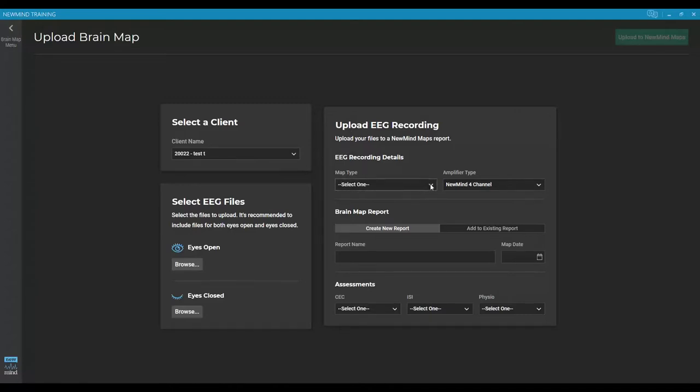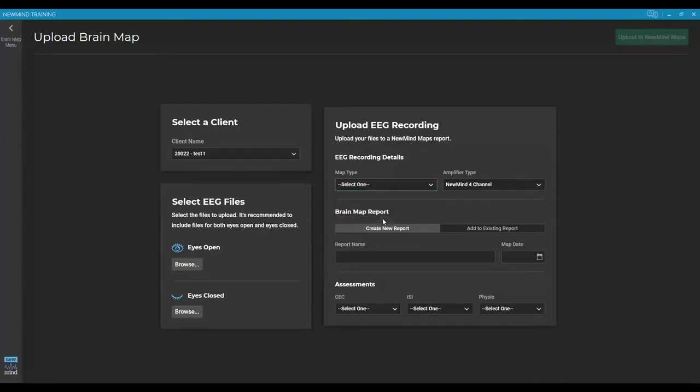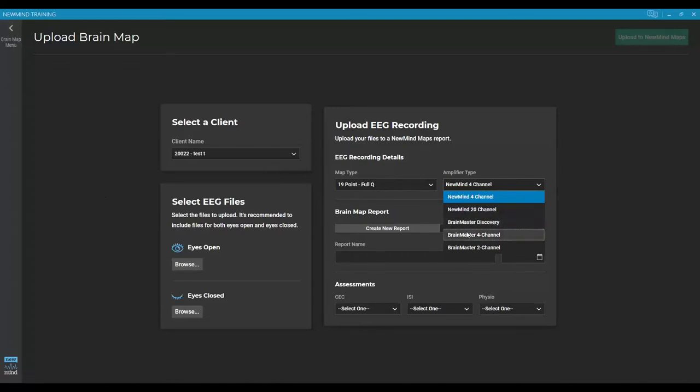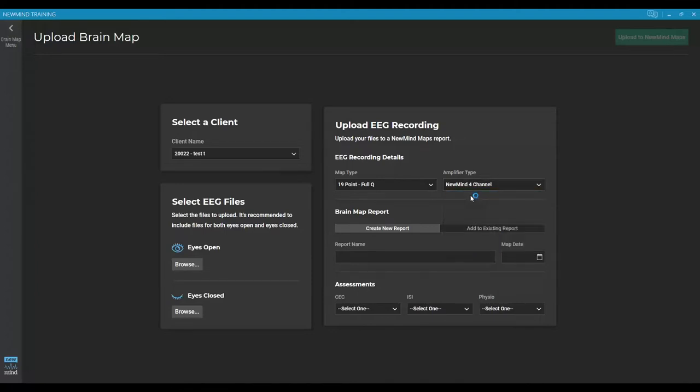Then I'm going to come over to the right side. Next thing it wants to know is the map type. So anyone using the newmind 4 or 20 channel amplifiers, we do a 19 point full Q. And then they need to know the amplifier type. So we have the newmind 4 channel, the newmind 20 channel, and you can also choose from a brain master discovery, brain master 4 channel, or a brain master 2 channel. The test I did was with a newmind 4 channel, so I'm going to select that.